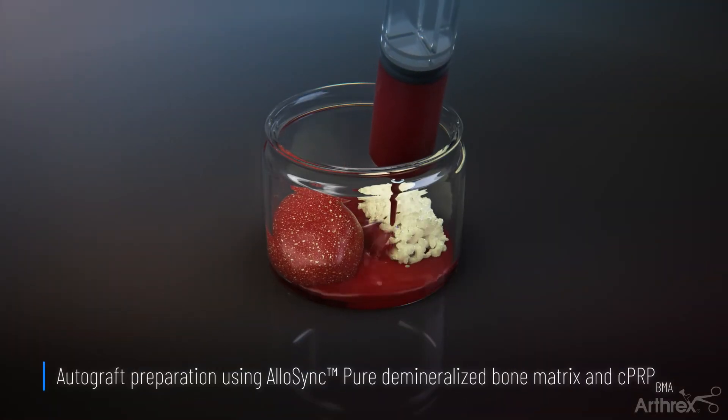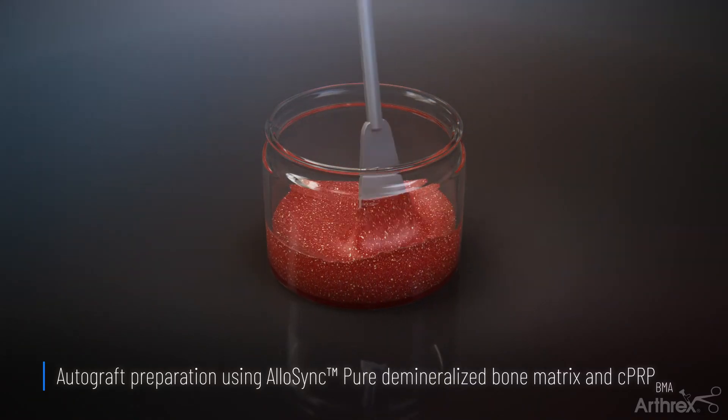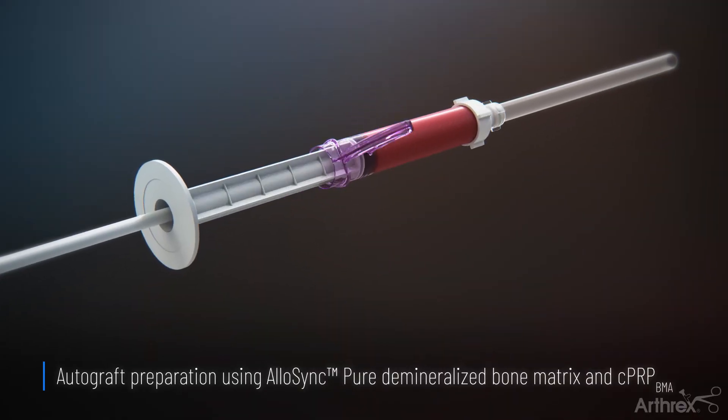The autologous collected tissue is then mixed with 5 cc's of Allosync Pure and CPRP from BMA. The mixture is then loaded into the Bio-Express graft delivery device.